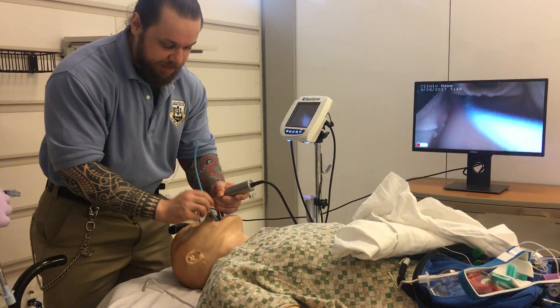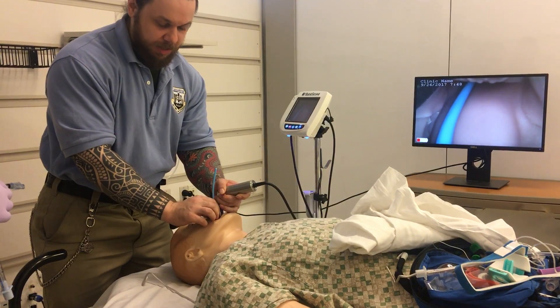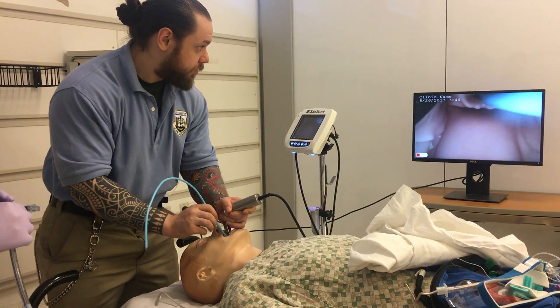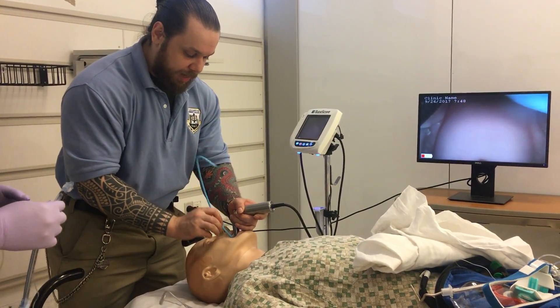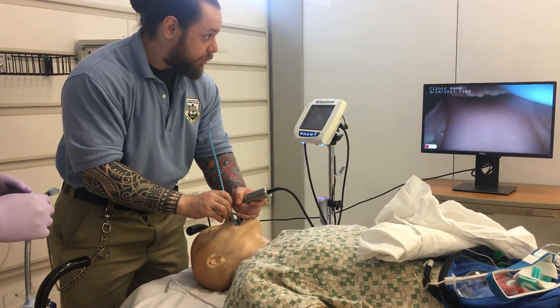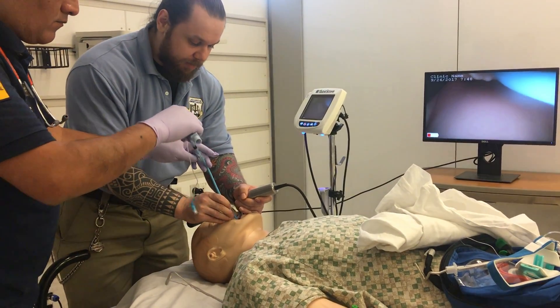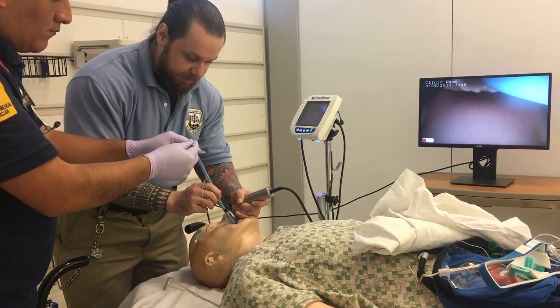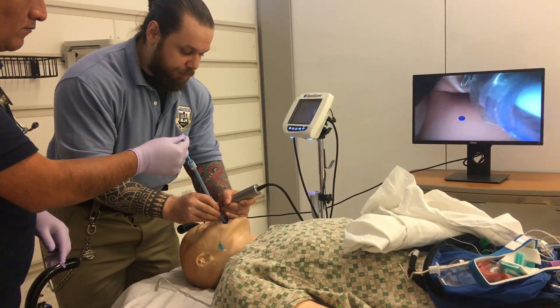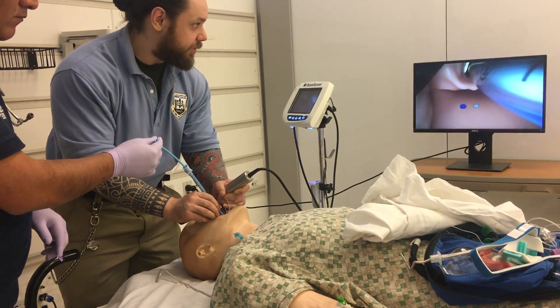If you go into the esophagus, notice that you can keep advancing — it goes much further because you're in the stomach. Once you confirm you're in the correct location by feeling the rings and hitting the carina, have your partner lace the tube over the bougie. Very important: maintain the laryngoscope in the airway while the tube is advanced. If you feel hold-up, pull the tube up slightly, twist it a little bit, and advance it further into the correct location.